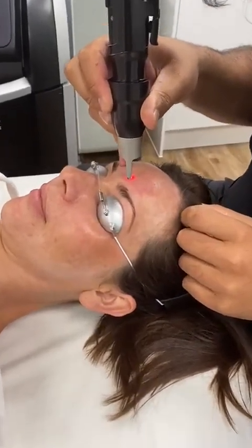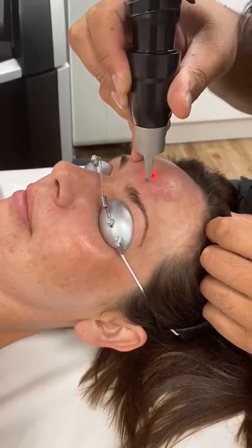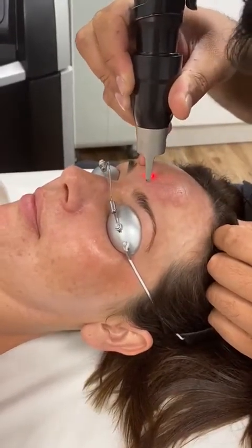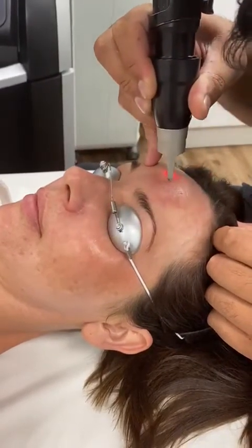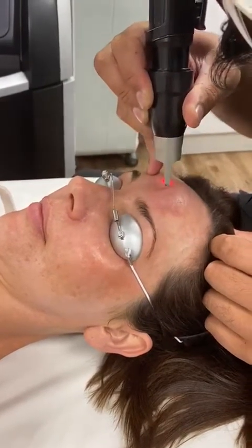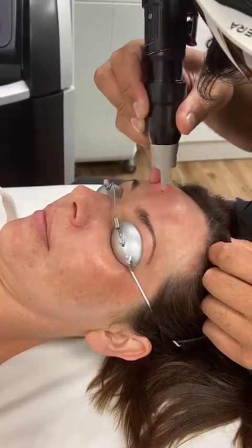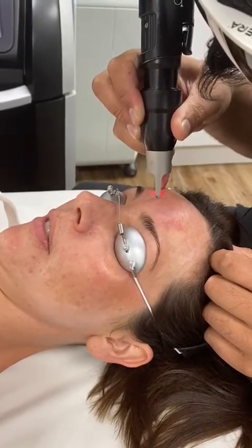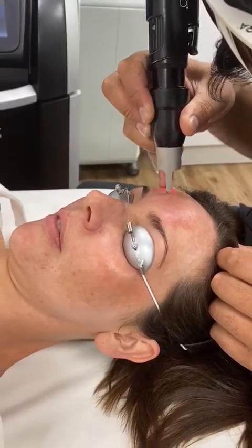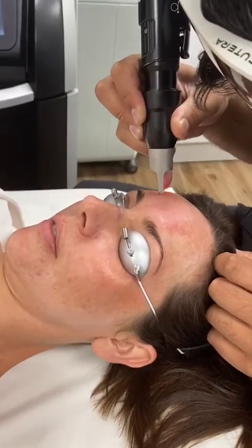If you zoom in here, you can literally see and hear the tiny popping noise that is consistent with that photomechanical effect. You can also see that I'm using a single pass painting technique to treat this. Can you feel any pain or is it very uncomfortable at all? You can see when we get to slightly darker areas of pigmentation, you can hear a slightly louder photomechanical effect.